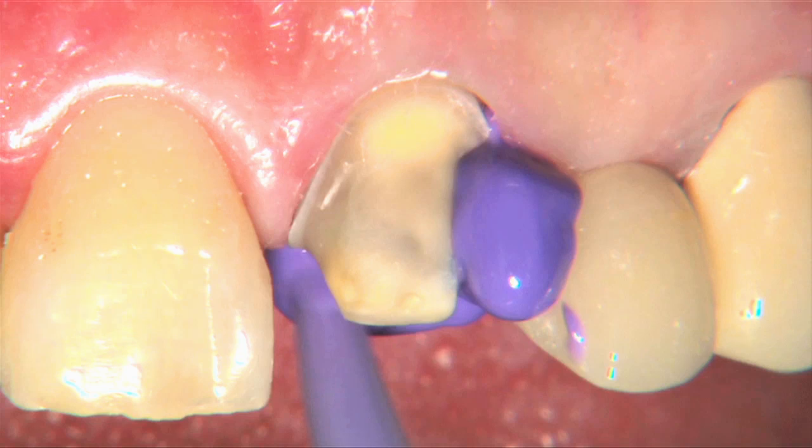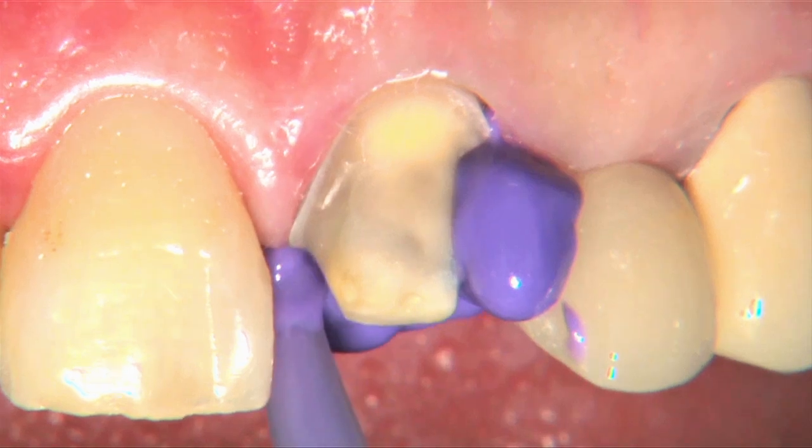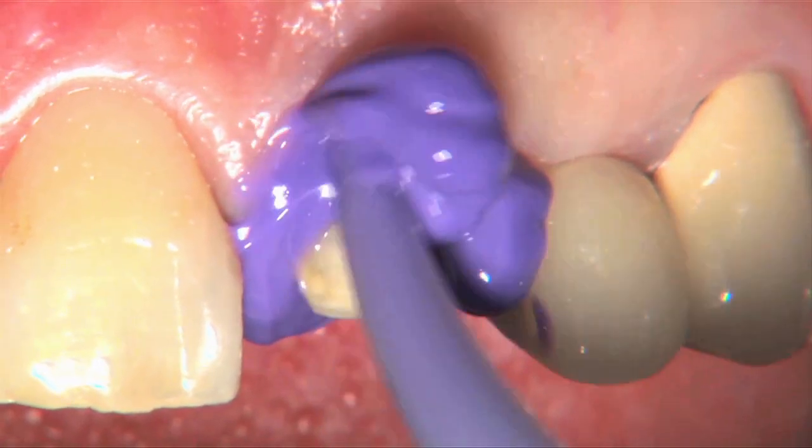By having the bottom cord still in place during this impression, we have no bleeding because we still have that cord in contact with the inflamed base of the sulcus. And also by having that top cord, we get a lot of lateral retraction of the tissue that we don't get in a one cord technique. And that lateral retraction gives us a wide open sulcus, and this would almost be an impossible impression to miss.